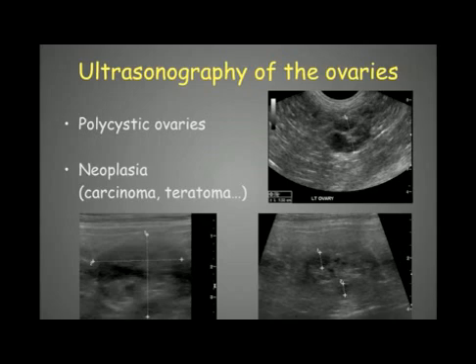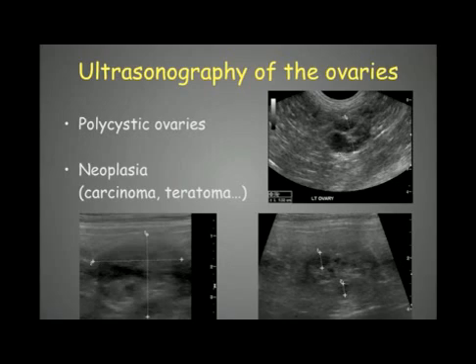In cases of persistent estrous, we will look mainly for polycystic ovaries, like we can see here, with multiple cysts visible. If the cysts are more than one centimeter, they are more suspicious for polycystic ovaries and not just the normal follicles of a normal estrous cycle. In general, we will see this condition bilaterally, so both ovaries will be affected.